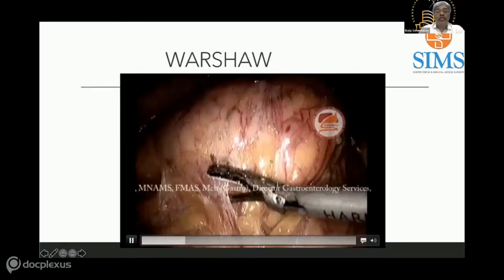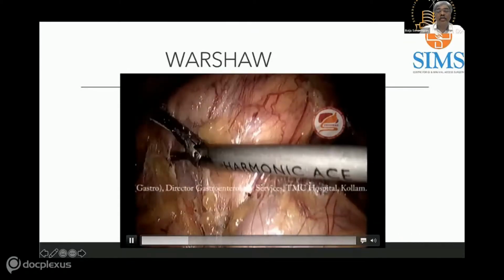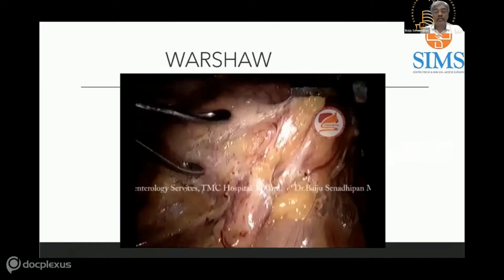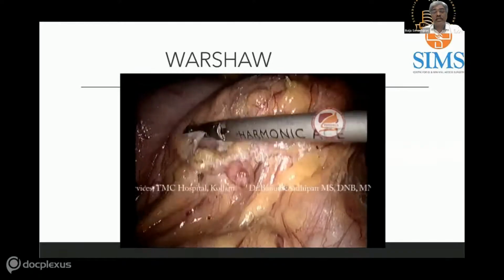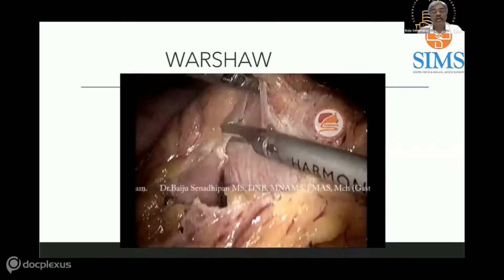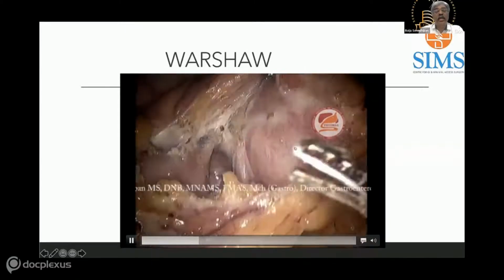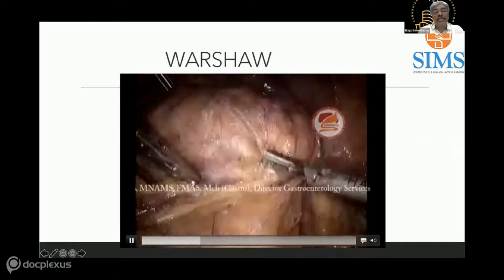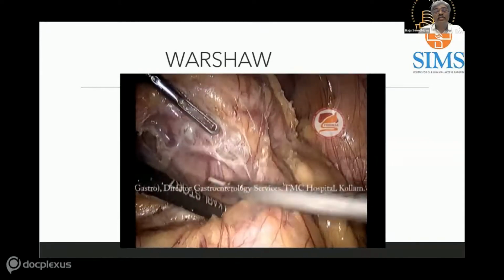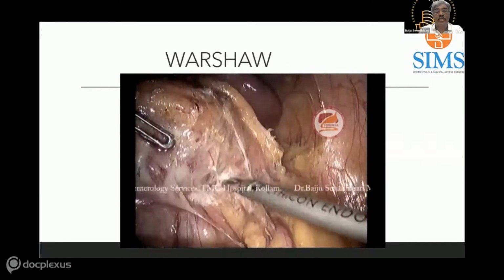Now that is the tumor which has to be removed. Now coming to the lower part of the inferior body of the pancreas, the attachment of the mesocolon is attached. This is the DJ flexure. What you are seeing is the DJ flexure that is taken down, and further mobilization just lateral to the capsule of the pancreas is taken down with the harmonic scalpel.